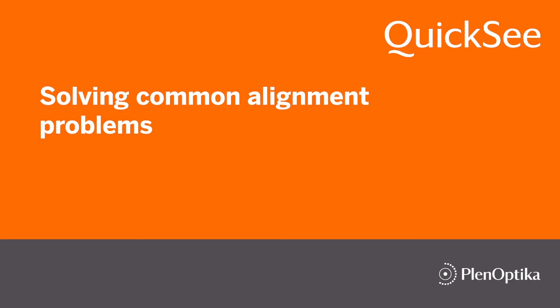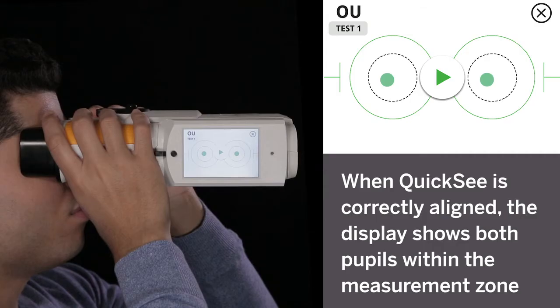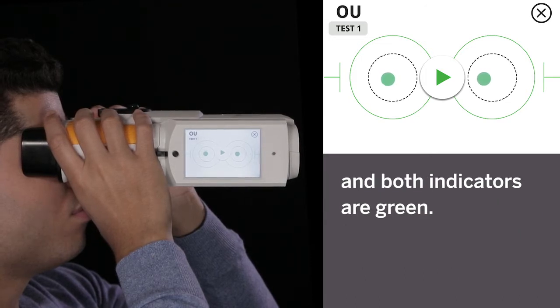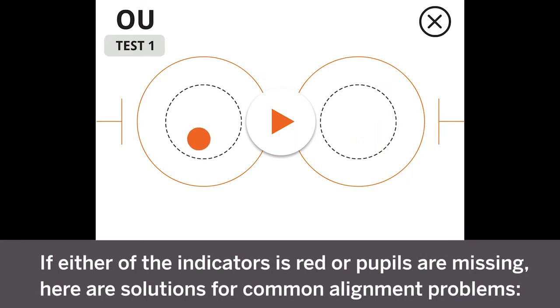This video will show solutions for common QuickSee alignment problems. When QuickSee is correctly aligned, the display shows both pupils within the measurement zone and both indicators are green. If either of the indicators is red or pupils are missing, here are solutions for common alignment problems.